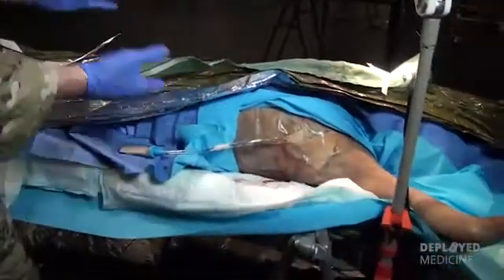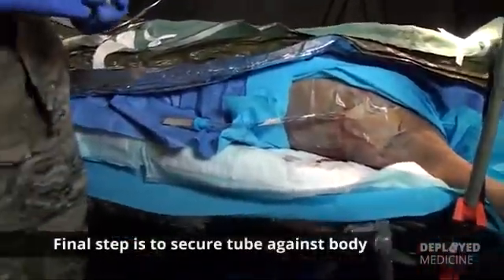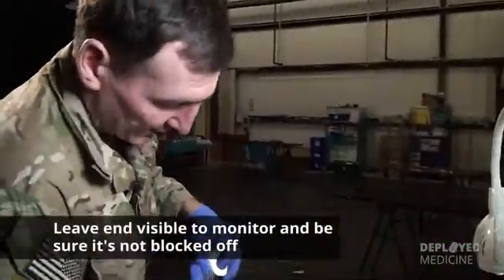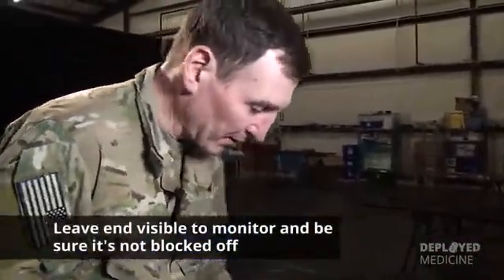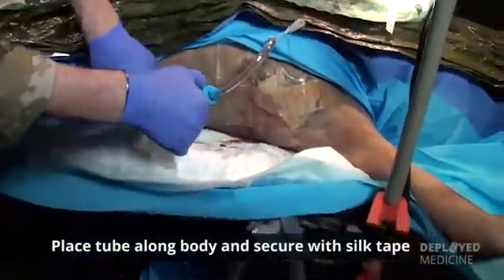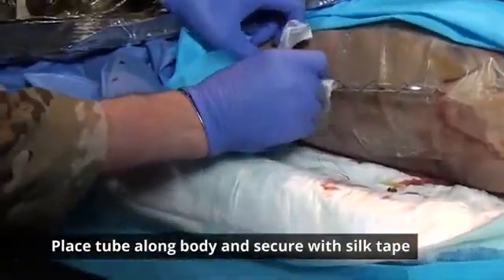Okay, once that's done, the only thing left to do is really secure the chest tube against the body, just so you don't have this out here kind of flopping around. It can be done again in any number of ways, preferably just simply taping it against the body with silk tape.